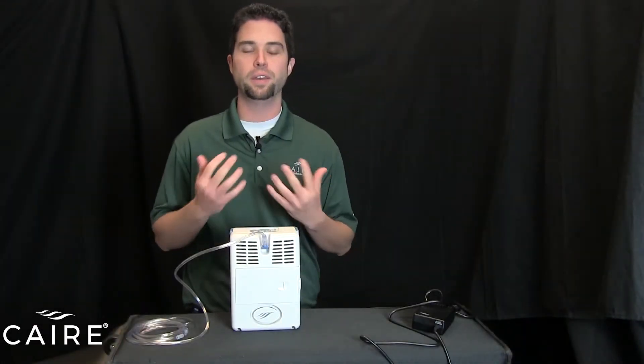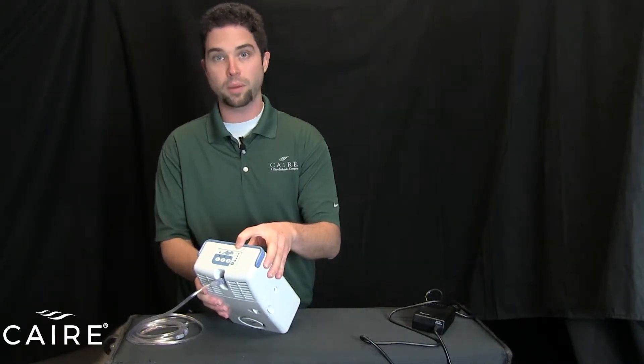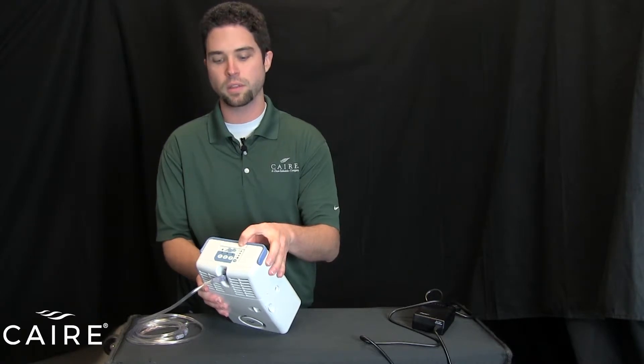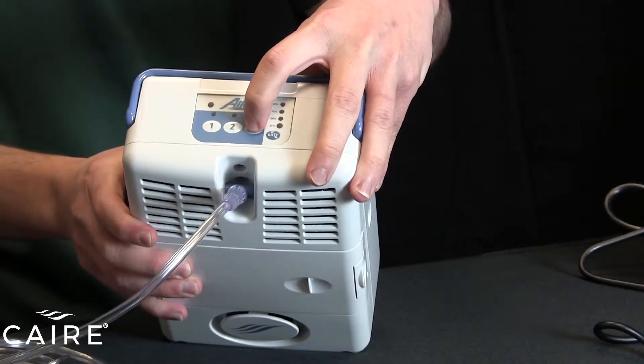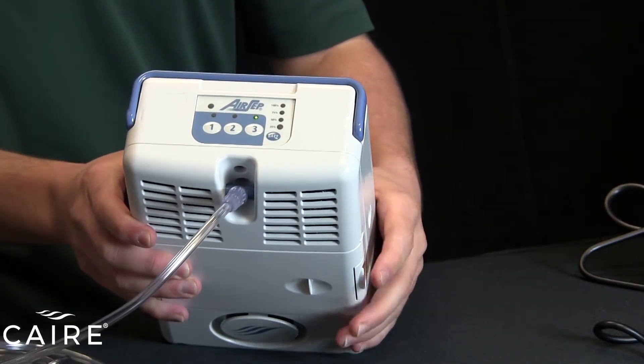Once you've checked your battery, you're ready to turn the unit on. To turn the unit on, all you do is press the button of your prescribed flow rate on top of the device. It's a very simple one-touch operation. So for instance, if I'm on a setting of three, all I do is press the button three, and the device will turn on and the light above the number three will illuminate to let you know that's the setting you're running on.